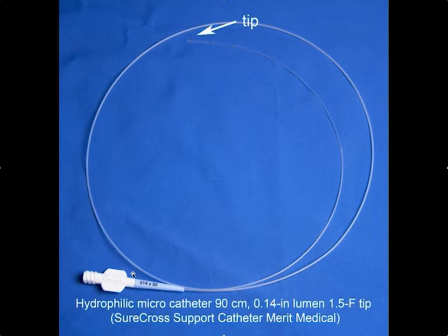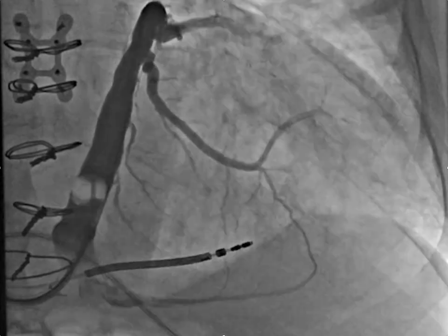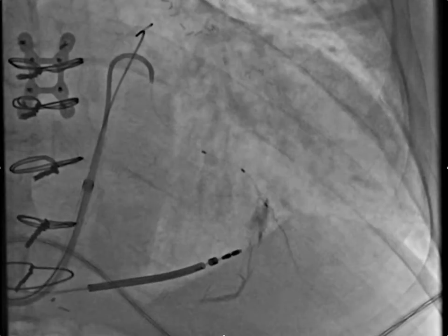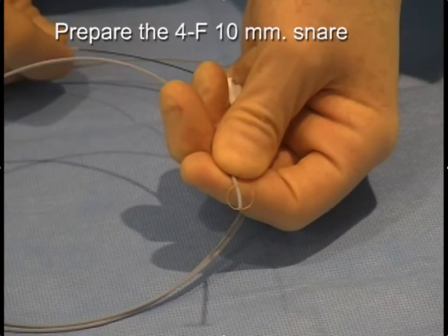One thing you can do to facilitate advancing wires through the collaterals is to use the Surecross micro catheter. If you're having trouble getting the wire through the collaterals, slide this micro catheter over the wire already in place — that provides additional support to advance the wire. You can also exchange wires to get a fresh wire without a bent tip. This micro catheter can make it possible to get through some difficult collaterals. You can inject some contrast to see where it is, then reposition and get through the collaterals.